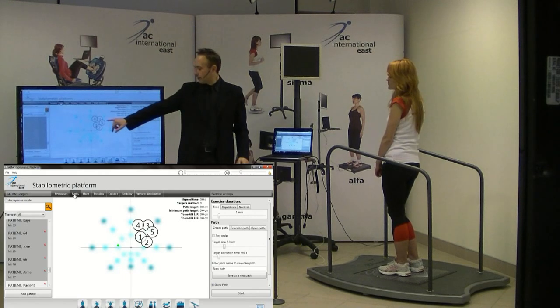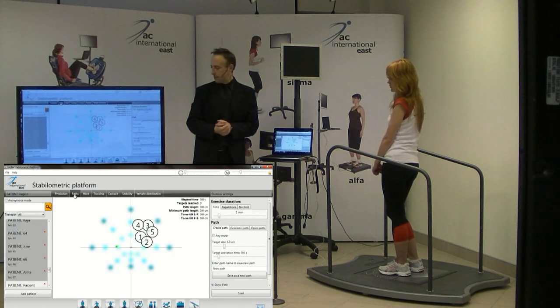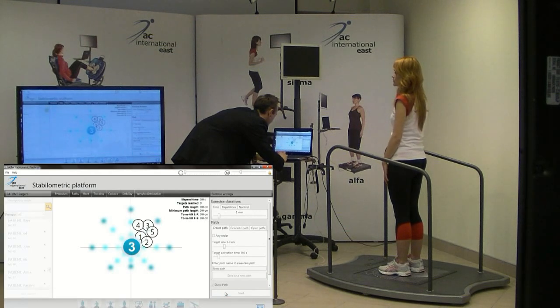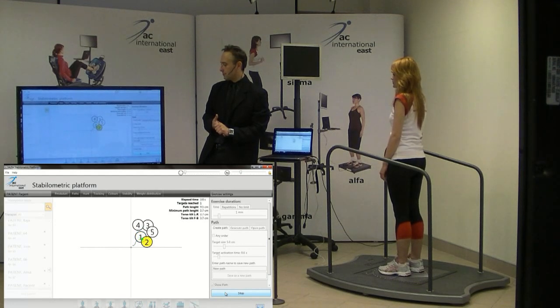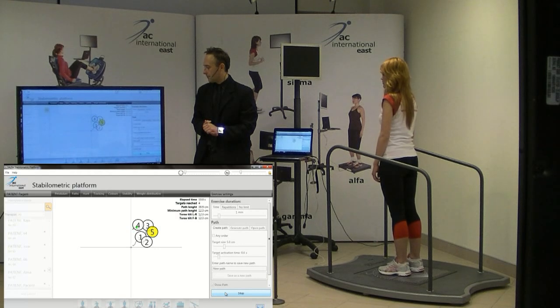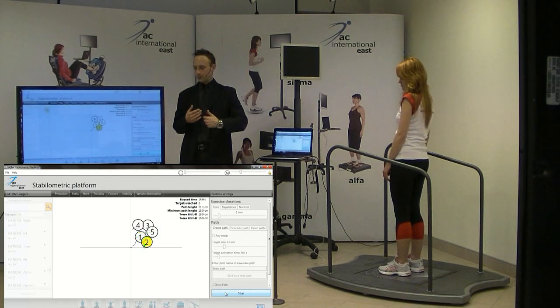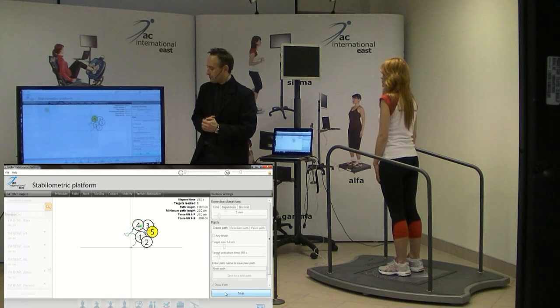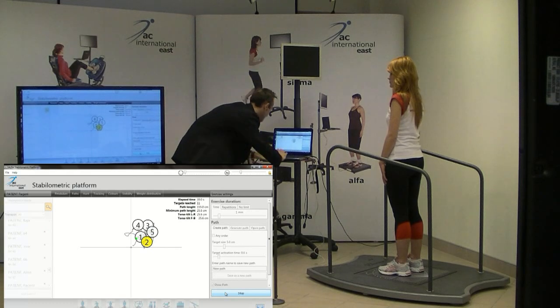Okay, so your aim will be to go from the first circle to the fifth. They will be highlighted going from 1 to the 5. Okay, so we can start the exercise. So you go from the first to the fifth circle. Okay, you achieve the first one, the second one, then the third one, the fourth, and the fifth one. Okay, and we can do such exercises. So you still work in the one quarter, so you compensate the results from the test that was before. Okay, so this was the first exercise for you, called the path.